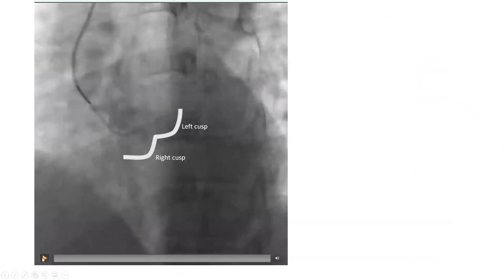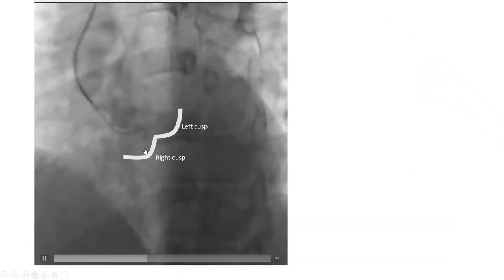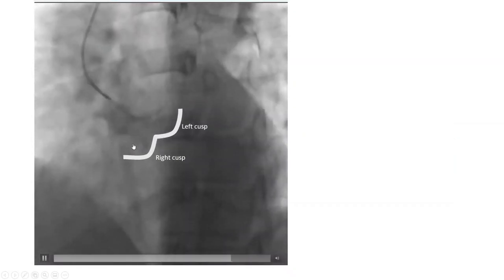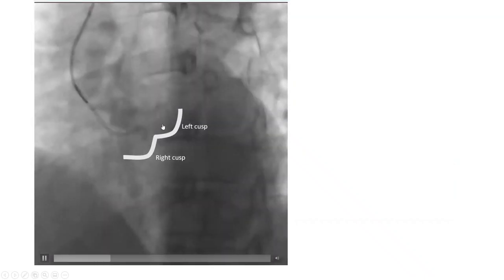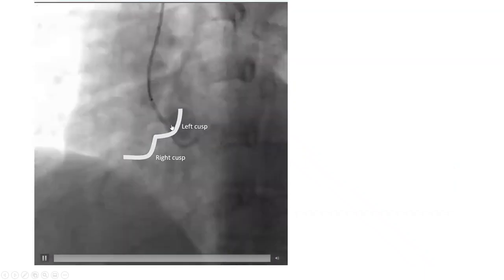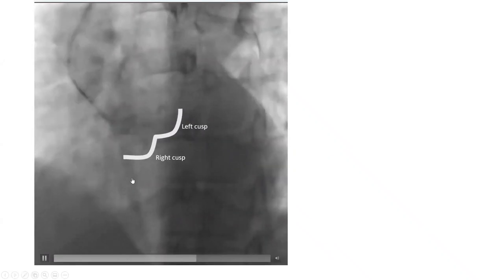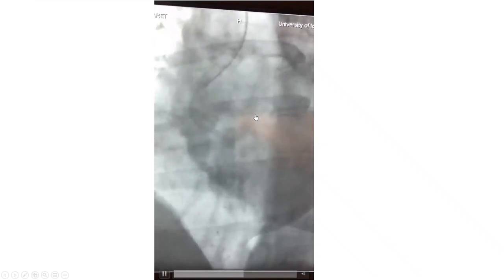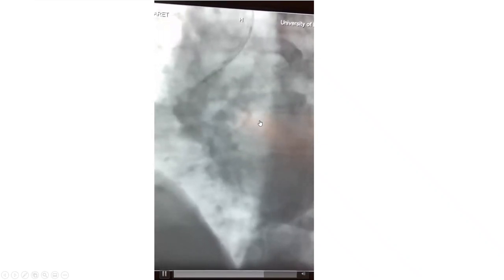Here's a case to illustrate. The catheter fell into the right cusp, then we pulled it to jump into the left cusp — that's the first basic maneuver with a Tiger catheter. In another case showing how to loop from below: we were on the right cusp, jumped into the left cusp, then pushed to engage from below.